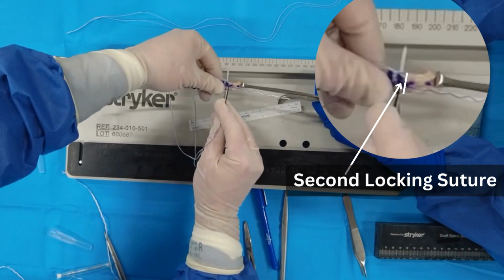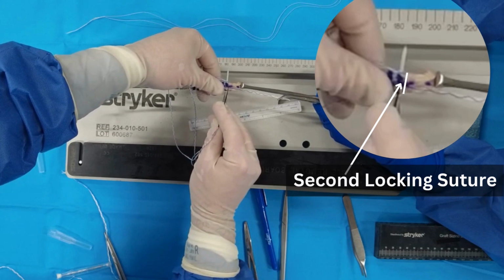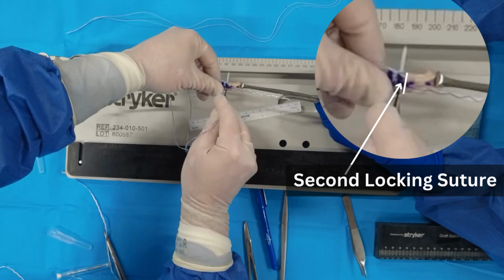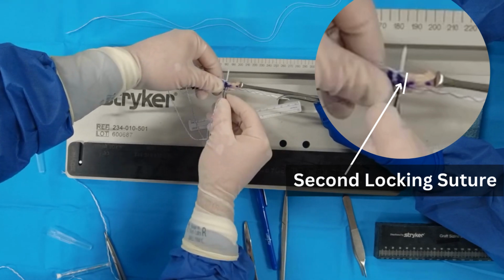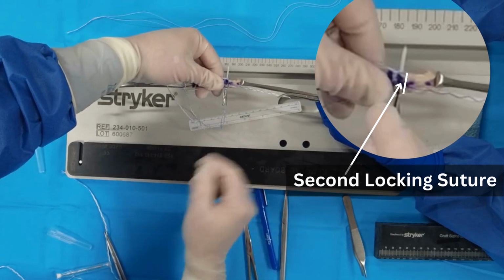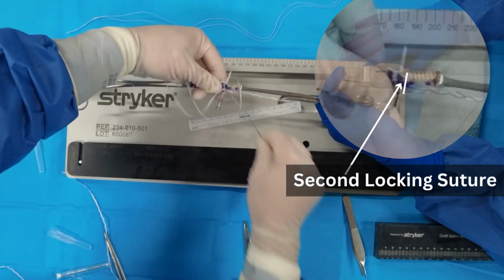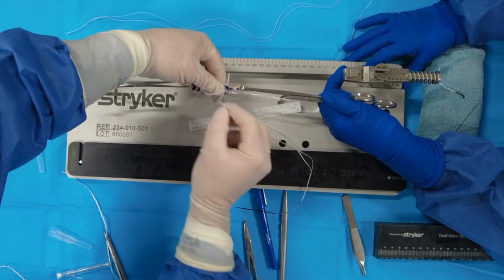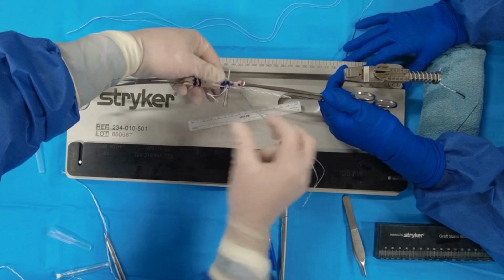And you can feel very confident that when you put your suspensory through this, you're going to have a length stable position, and it's going to be able to tolerate a high degree of tension. And it's relatively high up in the graft. This is due to the fact that we're going to have our suspensory tension much closer to the knee, similar to aperture fixation in that regard.